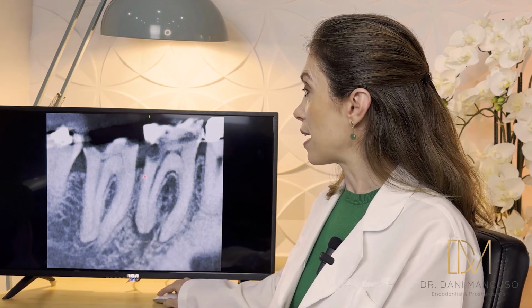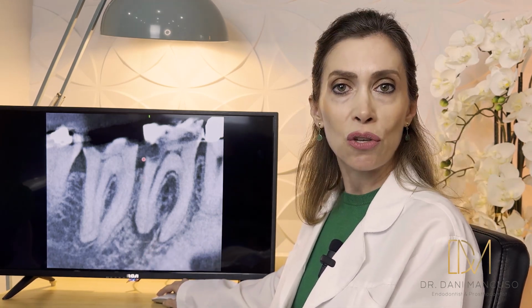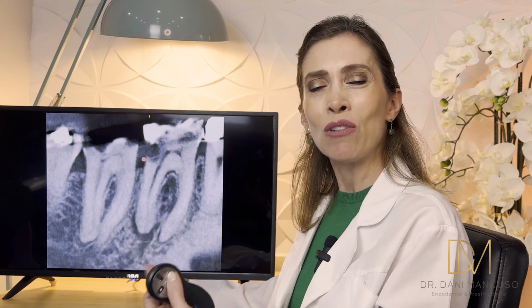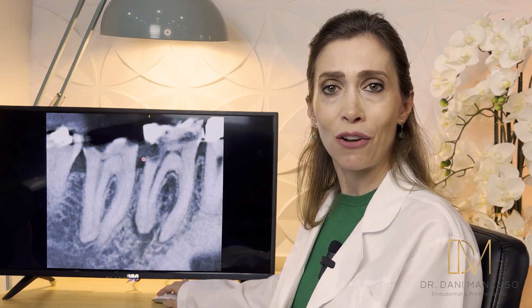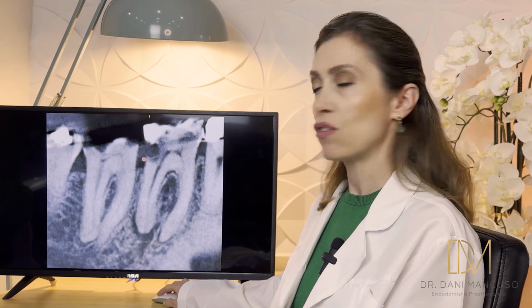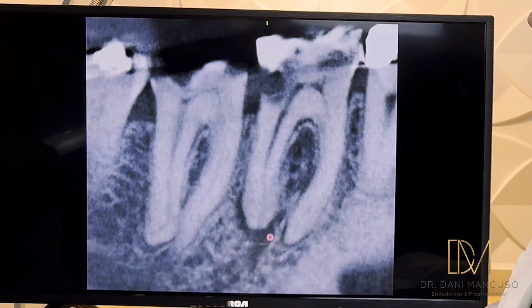But every time you go below the CEJ, for example, it becomes more and more compromised. In this case, it was quite clear that the tooth could be restored. Sometimes clinically it looks too bad, but when you take the x-ray, you see more inside of the bone, and then it becomes clearer whether we can save this tooth or not. So a bit more evident where the periapical radiolucency is.